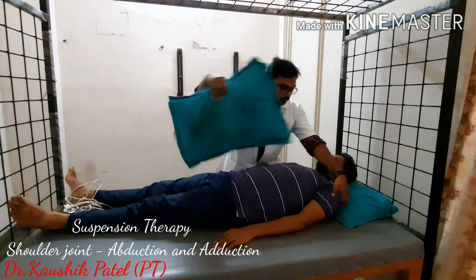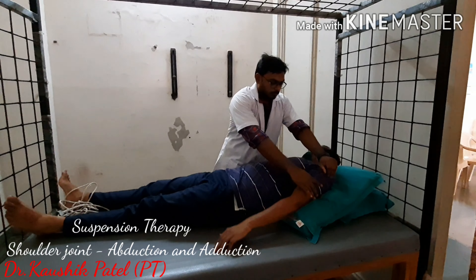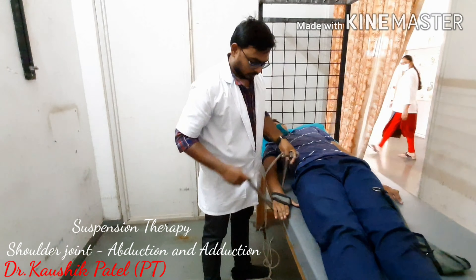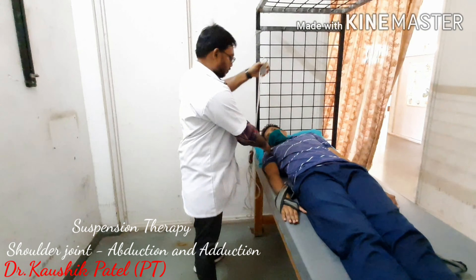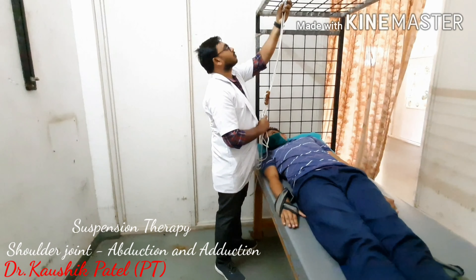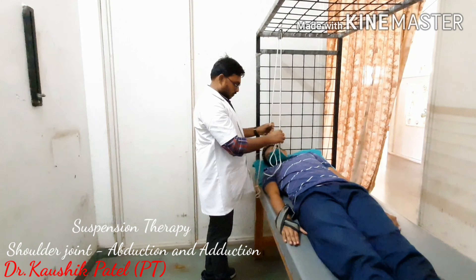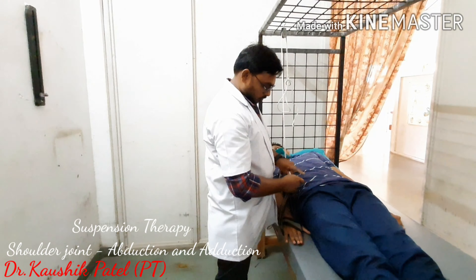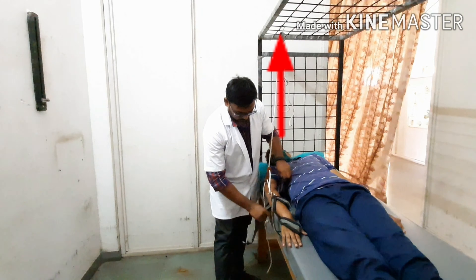Suspension therapy: shoulder joint abduction and adduction. The patient's starting position is a quarter 15-degree turn from supine. Two single ropes are required — one attached to a single sling under the elbow joint, and one two-ring sling applied to the wrist and hand. A three-ring sling can be used instead of a two-ring sling. The fixation point is over the shoulder joint.